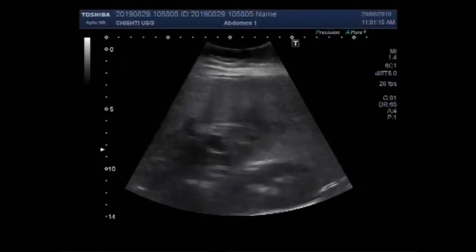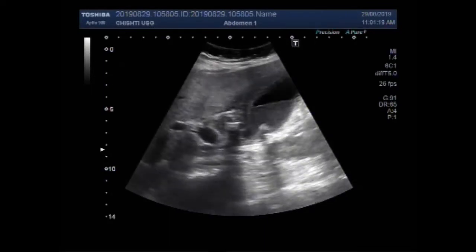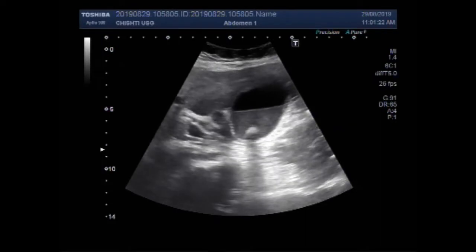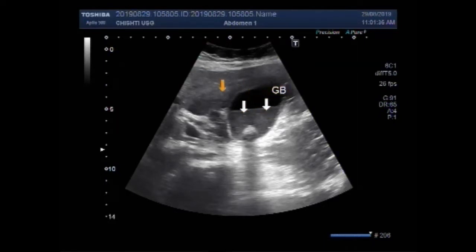Dear viewers, I hope you are all fine. This ultrasound video shows a stone in the gallbladder — cholelithiasis — and a large stone in the proximal portion of the bile duct — choledocholithiasis. Now this is the thick sludge seen in the dependent portion of the gallbladder, that is in the neck and adjacent portion of the body of the gallbladder.